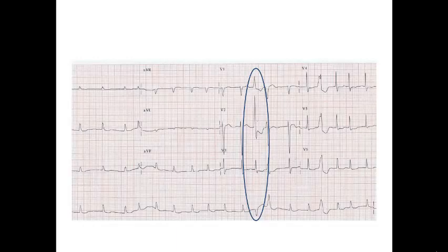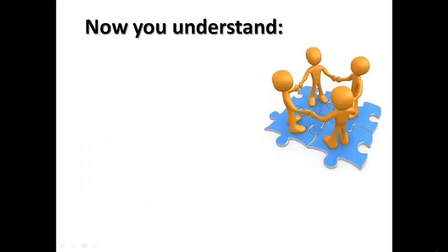So, of course, we need now to revise another ECG example here. As we can see, there is a patient with AF with nearly controlled ventricular rate. So the heart rate is not very rapid, or it may be, for example, at a high normal like 100 beats per minute. And the problem is in this beat, which shows right bundle branch block aberrancy because of the fact that there was a preceding longer RR interval then a shorter RR interval, which was terminated by this aberrant beat showing right bundle branch block aberrancy.